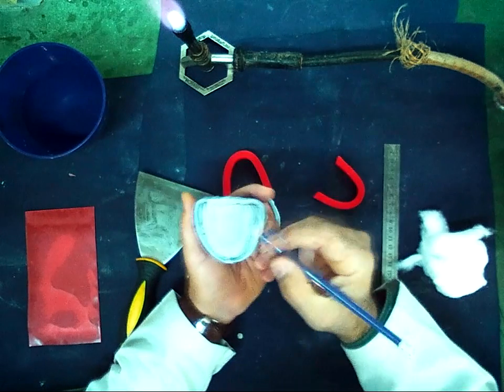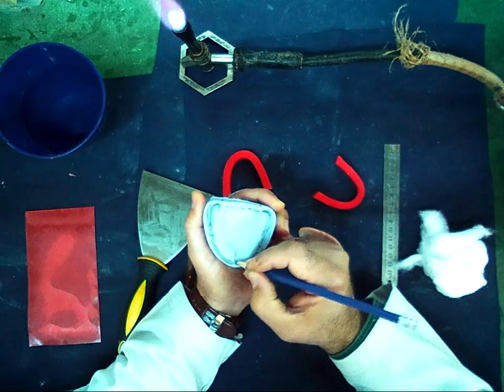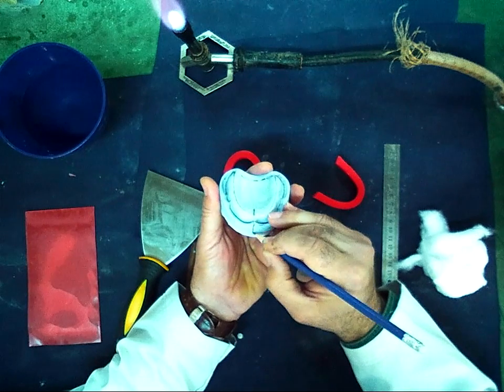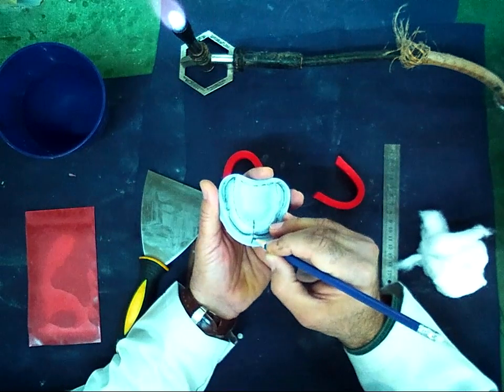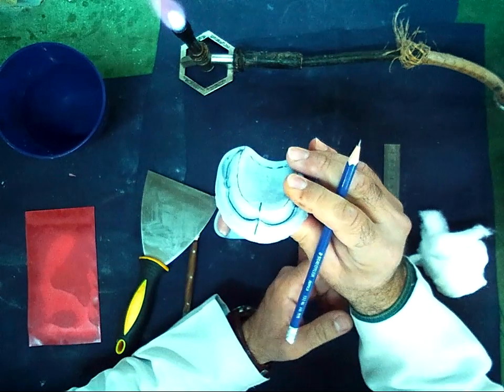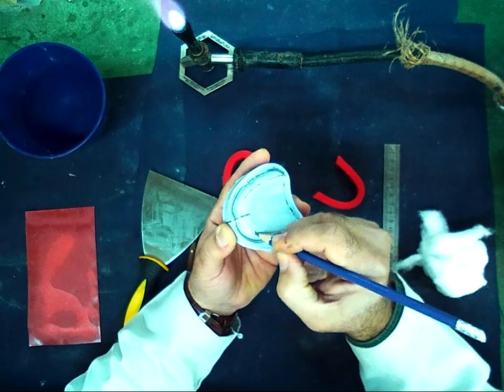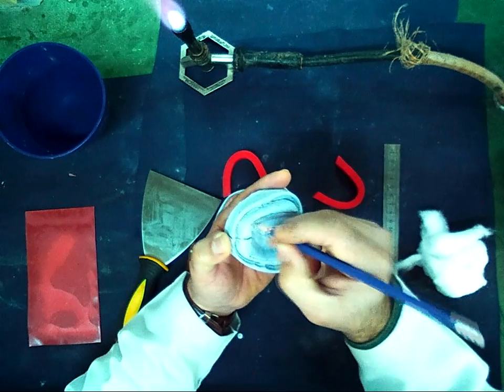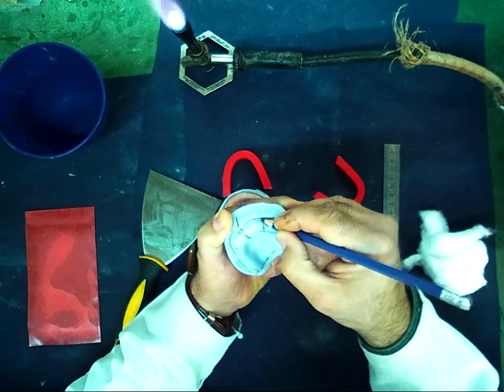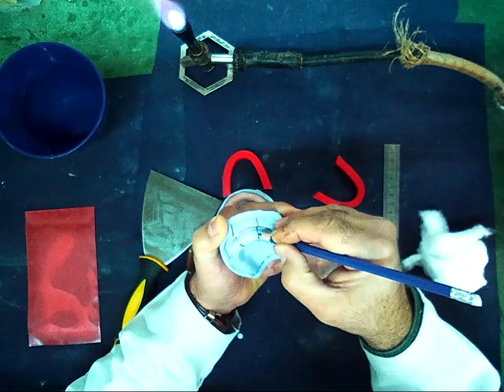I must also draw the midline from the incisive papilla anteriorly and in the anterior part of the cast. Also, the third line, I must draw it at the canine eminence, from the canine eminence to the anterior part of the cast.